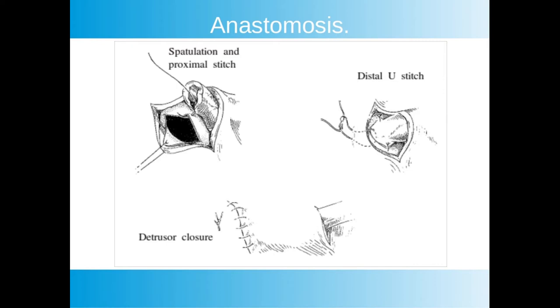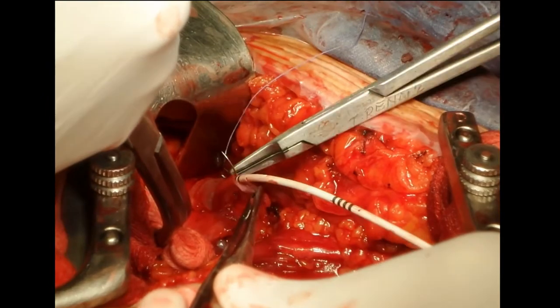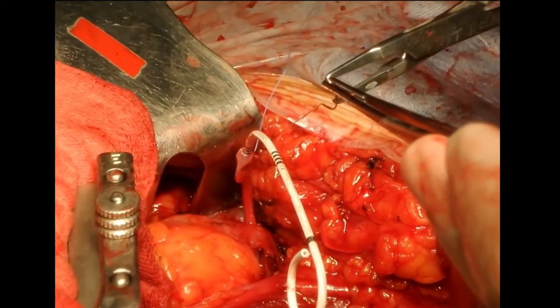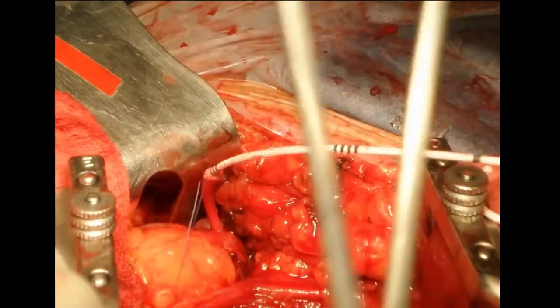The anastomosis is done with absorbable sutures, usually polyglycolic acid or polydioxanone. One suture is taken at the proximal end of the spatulation and joined to the bladder mucosa. Then we take the U-stitch that takes the distal end of the ureter inside the bladder lumen. The anastomosis is completed with two lateral sutures, and finally the detrusor muscle is approximated.